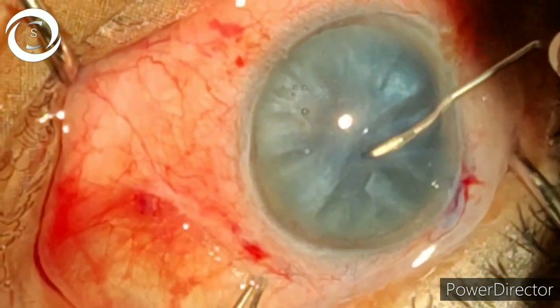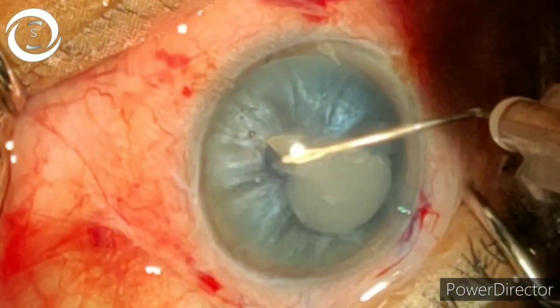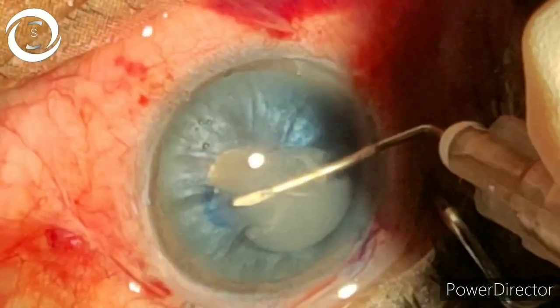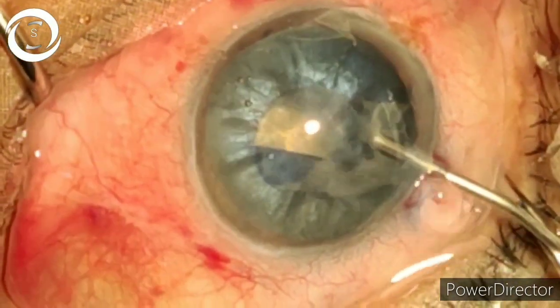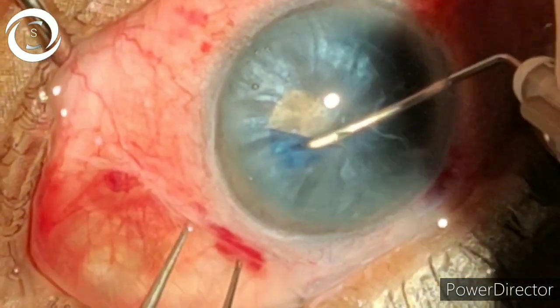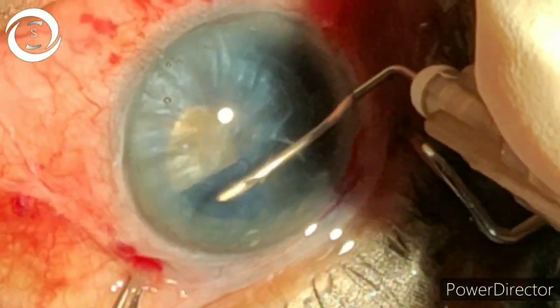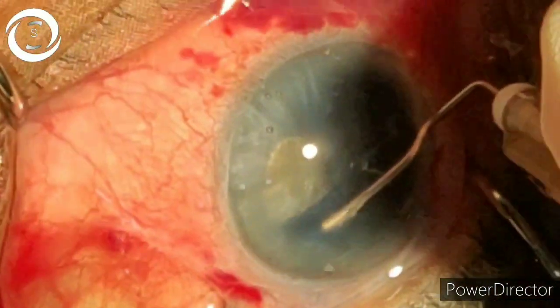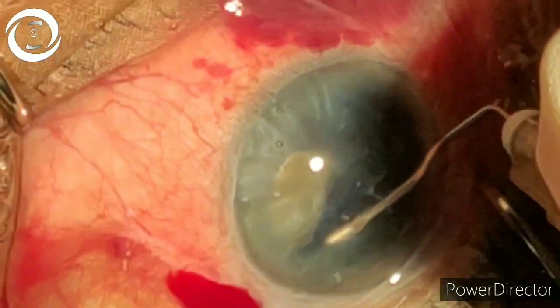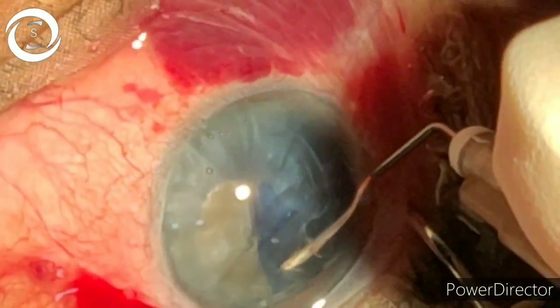Now the most important step — the rate-limiting step — is a good capsulorrhexis: a continuous curvilinear capsulorrhexis. As we gave the nick, due to intracapsular positive pressure the cortical matter came out, so we stopped the capsulorrhexis, removed that cortex, released the high intracapsular pressure, and then continued the capsulorrhexis.